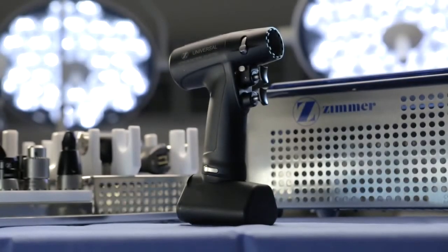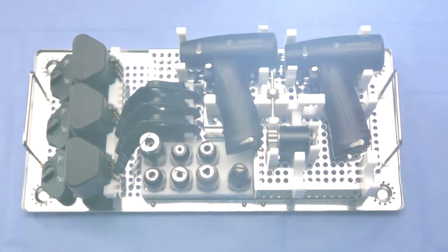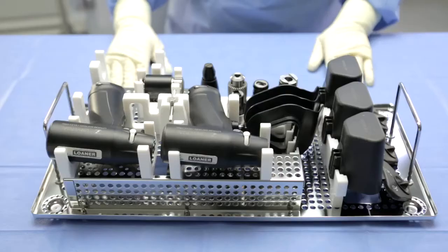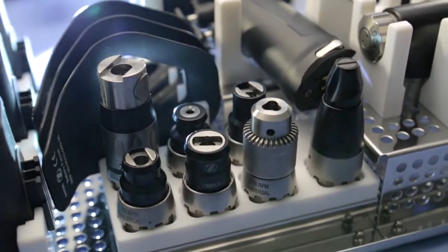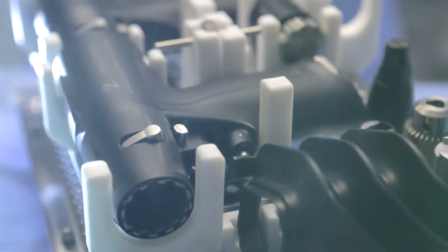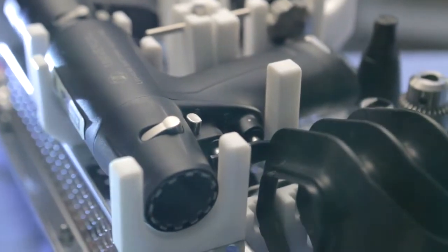A key design element of the Universal Power System is its modularity, meaning that a single handpiece can accomplish the required application of sawing, drilling, or reaming during a procedure. To accomplish the goal of modularity, the Zimmer Universal Power System utilizes individual accessories for each potential application. In this video, we will review the recommended methods for adding and removing both the batteries and the accessories before and during the procedure.